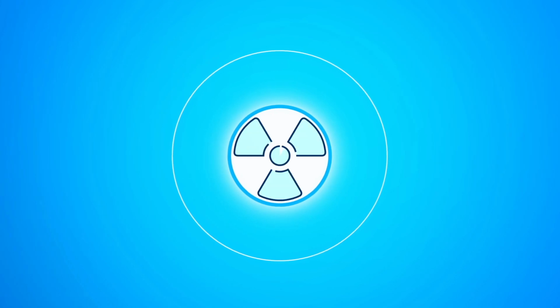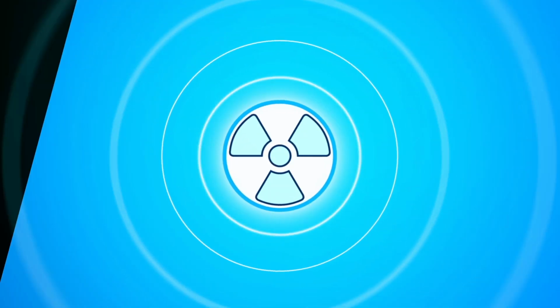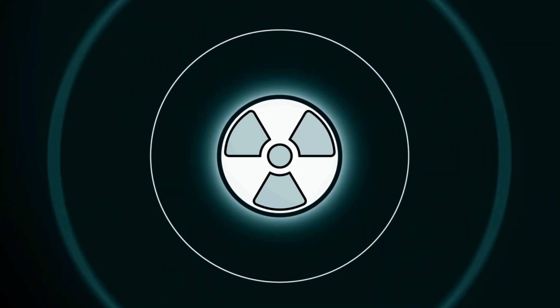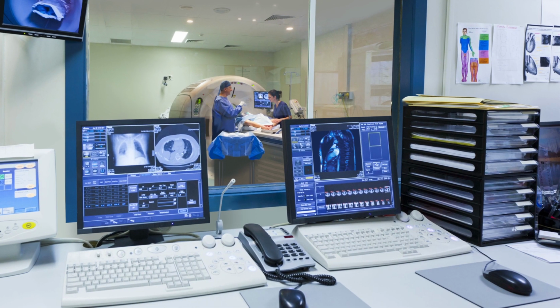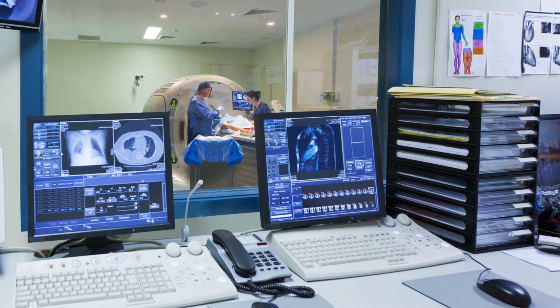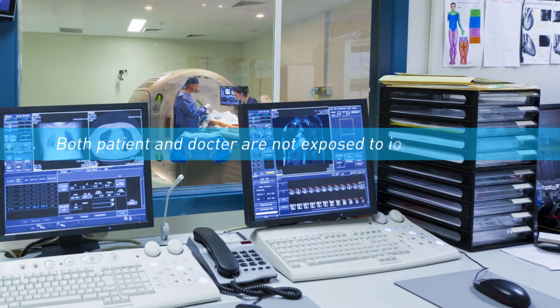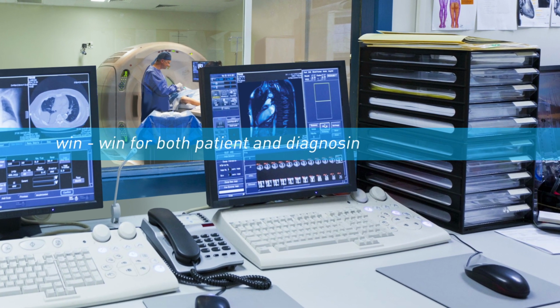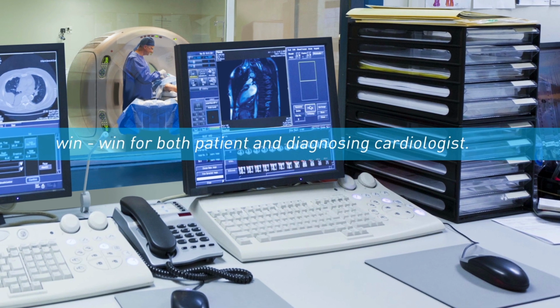CT scans and cath lab examinations usually involve radiation exposure and contrast media injection. Imagine you could combine a diagnostic cath lab procedure with an MRI scan. You would see the heart directly without contrast media, and your patient would not be exposed to ionizing radiation. This could be a win-win for both patient and diagnosing cardiologist.